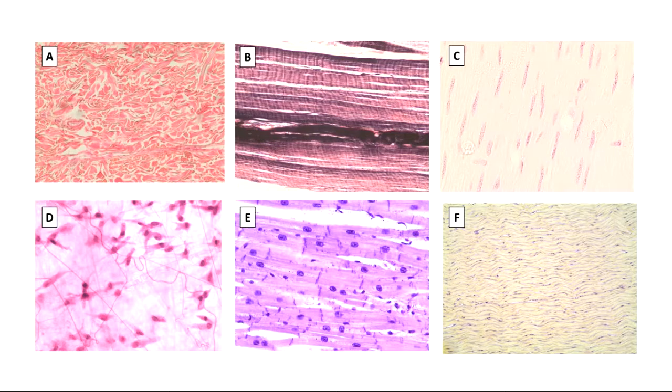My first question, which main tissue types can we see in these pictures? So epithelial tissue is one main tissue type. The other ones are muscle, nervous, connective. What do we see? Okay, a lot of us agree. We definitely have muscle tissue on here. We also definitely have some types of connective tissue on here.